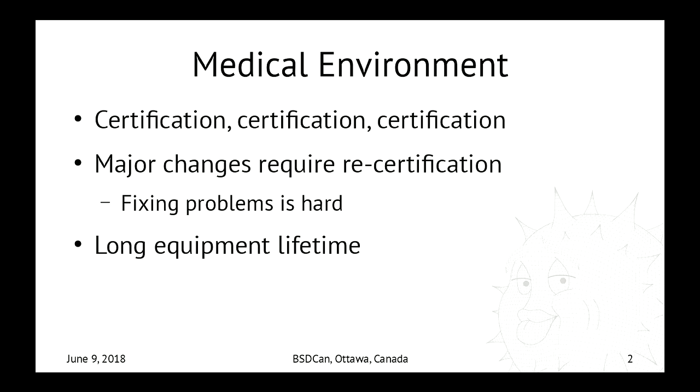We are dealing with certification elsewhere, but the medical environment, well, it's certifications on certifications on certifications. Each and every change that is not completely minor to any system involved requires recertification, which is time-consuming, expensive, and they try to avoid it. That means fixing problems is hard, and you better get stuff right from the start.